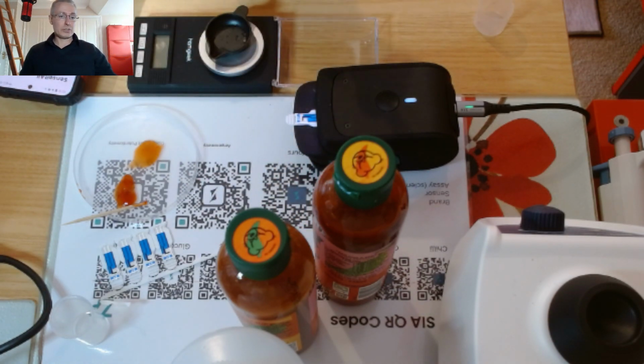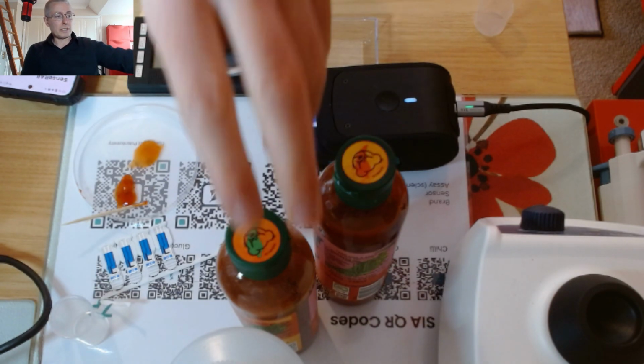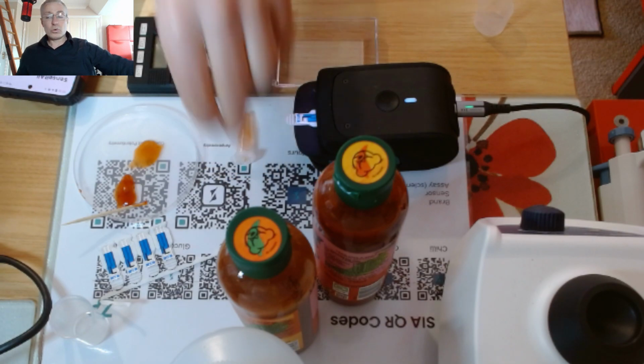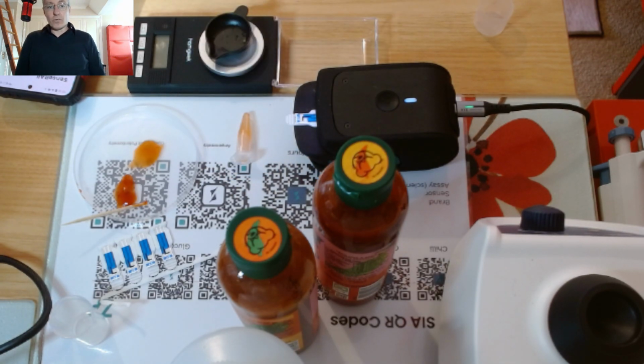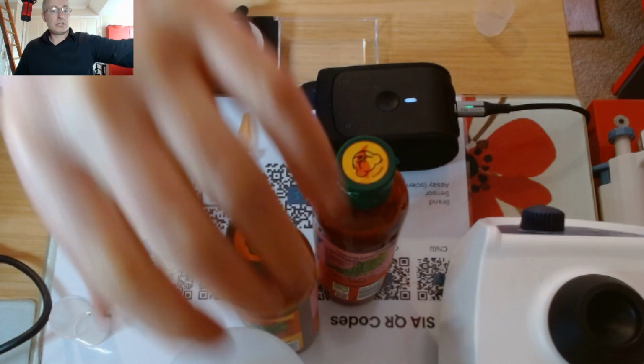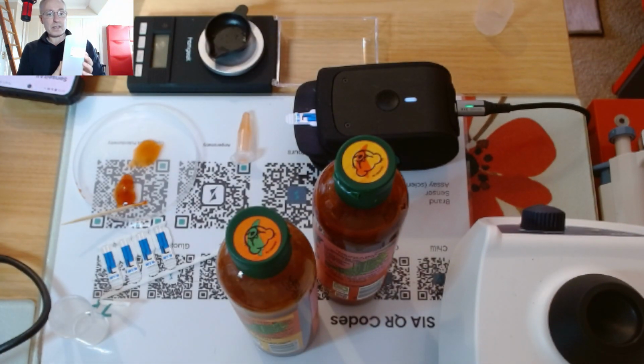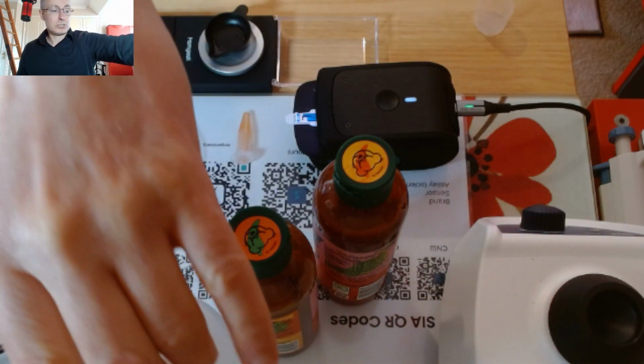Right, so I should describe this. When I was making the video about the Tingly sauce, I pipetted the sauce because it was thin enough to pipette. This time I actually weighed the sauce. I weighed out 0.1 grams of the sauce and diluted it in 0.9 milliliters of the buffer, which comes with the Food Sense Generation 4.